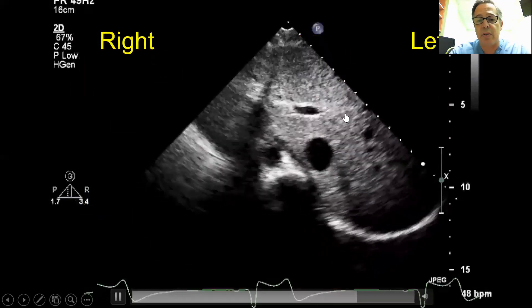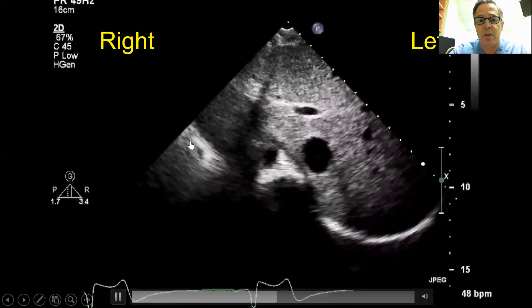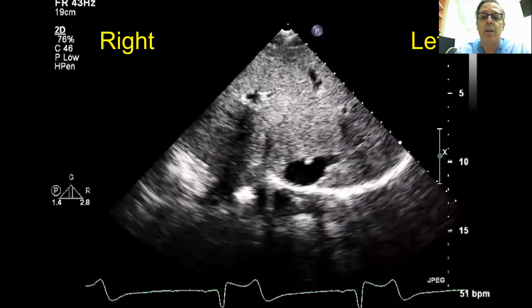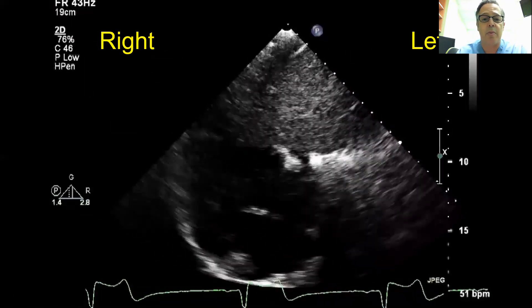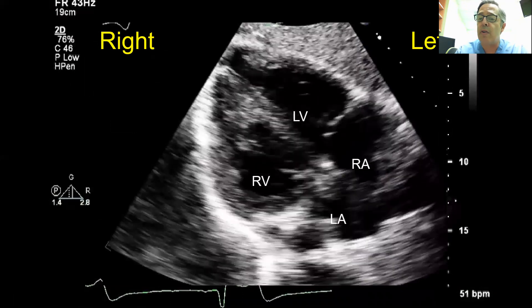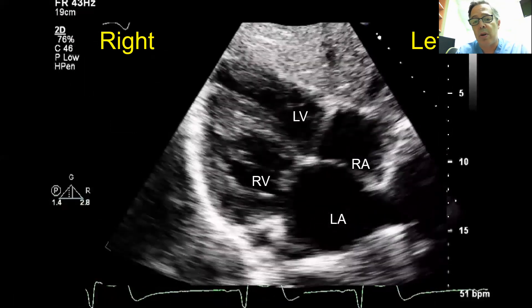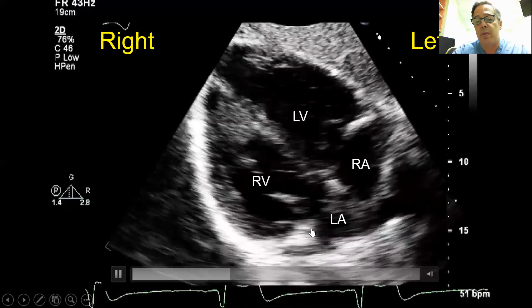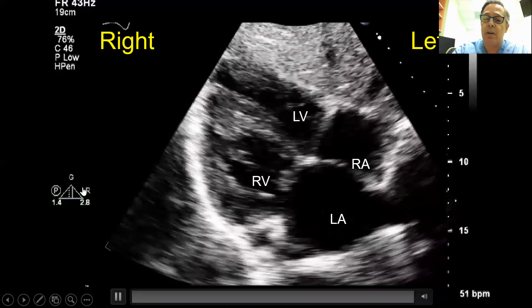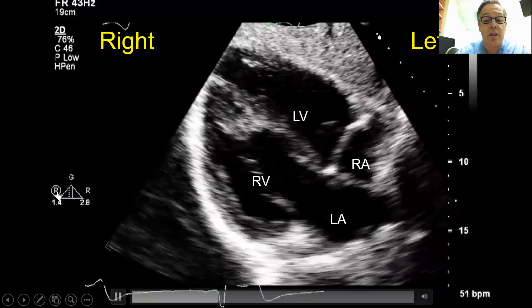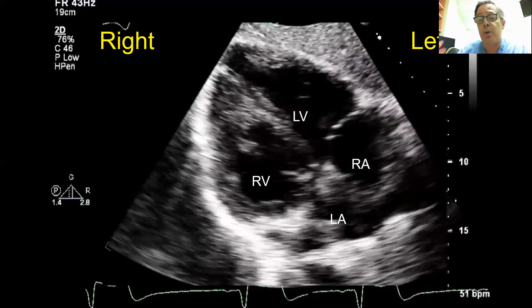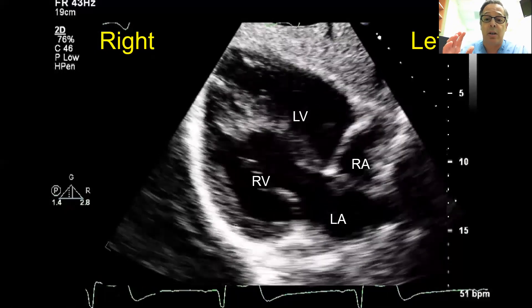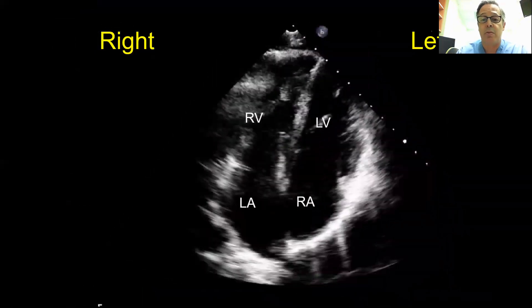This patient has situs inversus: the liver is on the left, you have the IVC and aorta here, and the stomach over here — situs inversus of the viscera. Sweeping up into the chest, you clearly see the heart is in the right chest with the apex pointed right. This is a very complicated case with AV discordance: the right atrium is connected to the LV which is on the left, and the LA is connected to the RV on the right — a very complicated congenitally corrected transposition. You can see how the sequential segmental approach helps you put these blocks together piece by piece.